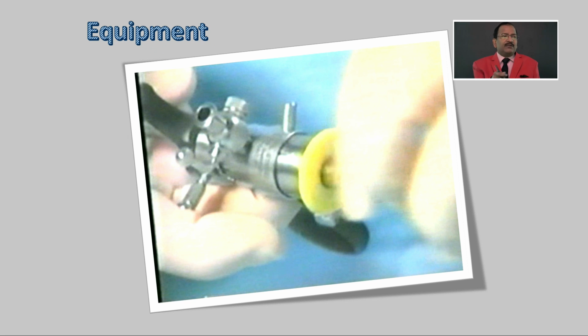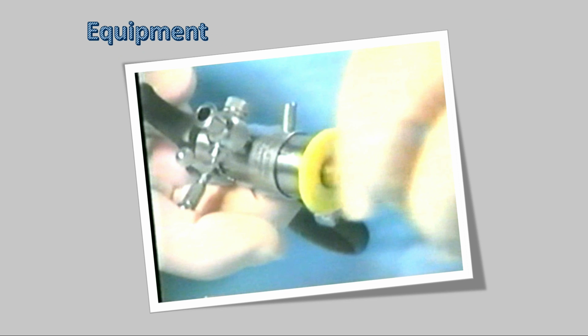So that's why whenever you take the instrument out, always one hand you should hold the cannula, then take the instrument out. Same way here also, you should not take the outer sheath out often. And suppose sometime your outer sheath is loose and gas is leaking, fluid is leaking, then what will you do? You should take a Roeder's knot or Mishra's knot and keep it on the outer sheath and tie around the cervix and tighten it by knot pusher, your leak will stop. So you will tighten it around the outer sheath.